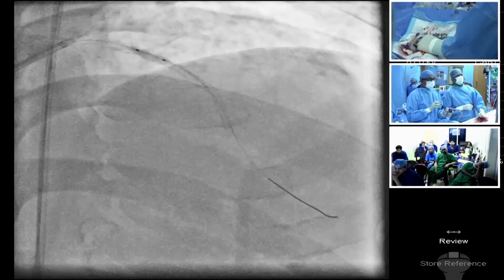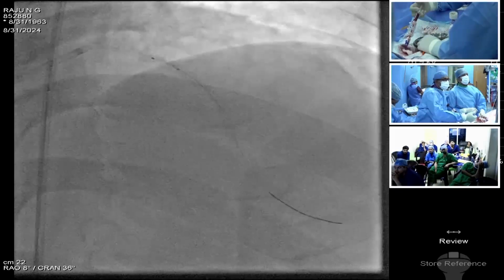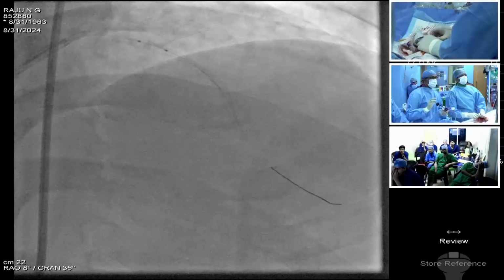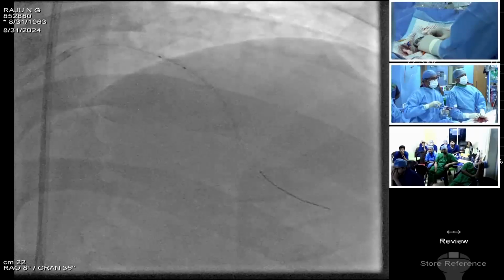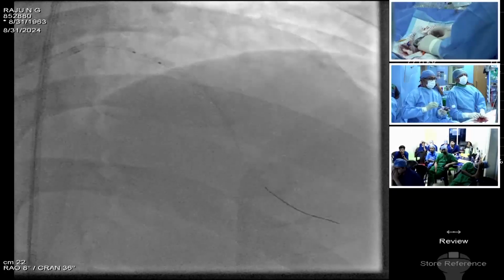It's open. Okay, negative. When it opens up like this, it's always good to have a small puff to make sure that there is no perforation. Okay. We'll pull back a little bit. No. The entire stent has been post dilated. Proximal. Okay. Now we do an OCT run.